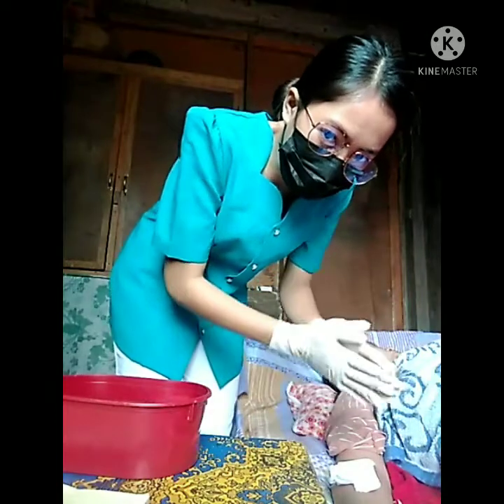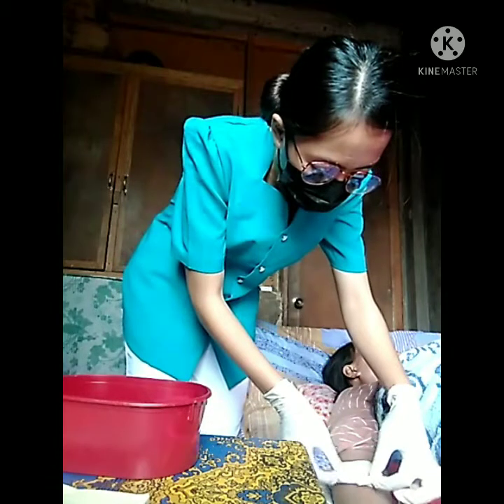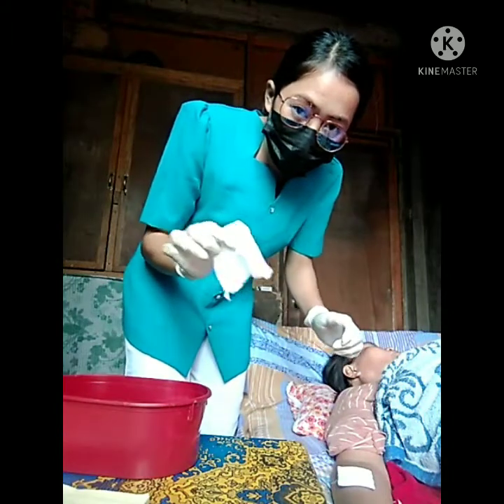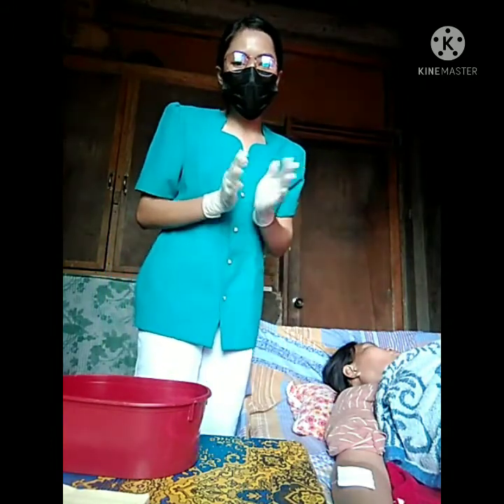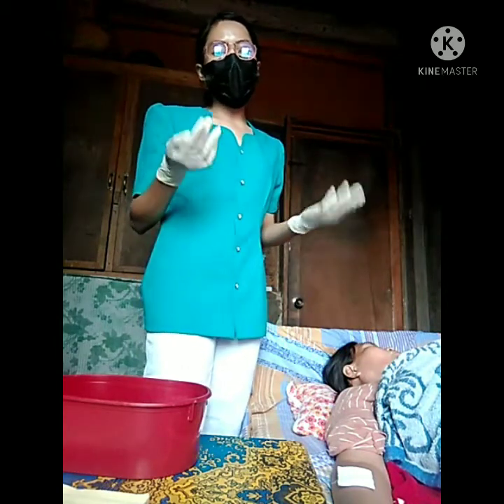You need to be careful in removing the gauze, and then put it in the waste receptacle. If the dressing sticks on a wet-to-dry dressing, do not moisten it. Instead, gently free the dressing and alert the client of potential discomfort.